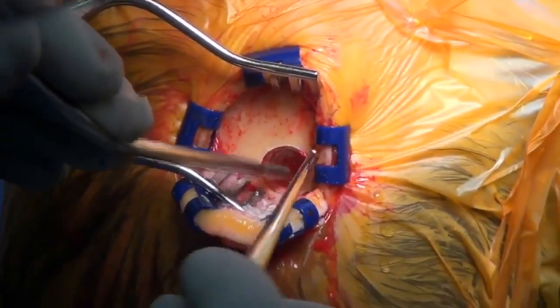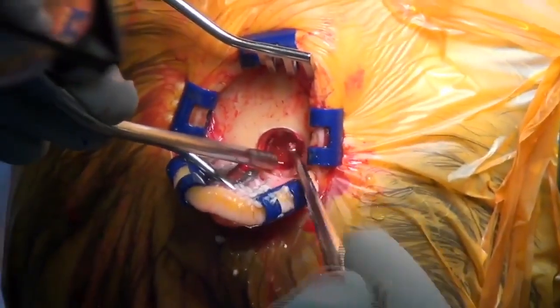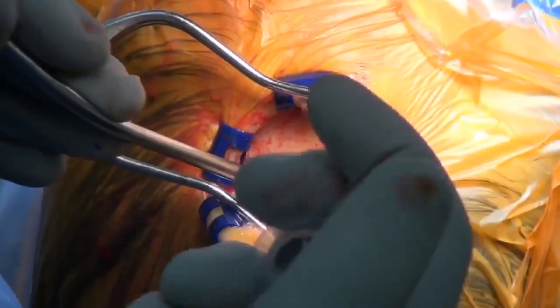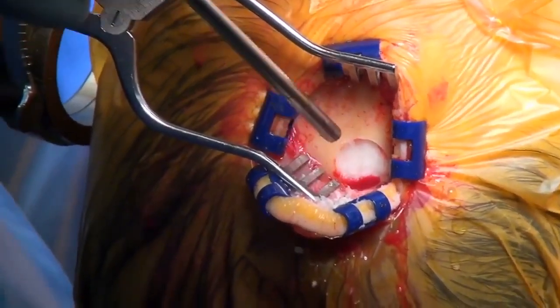So I'm just kind of clearing that off right now. That's good. Okay, flow seal. That's our little magic stuff. Stops any bleeding. Then let's get the stim lock. Let's get the magic stuff again.